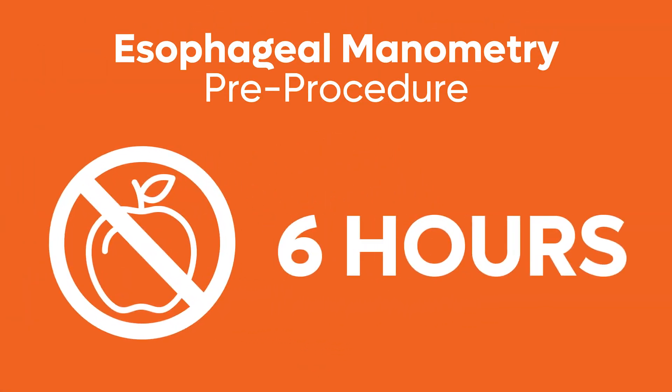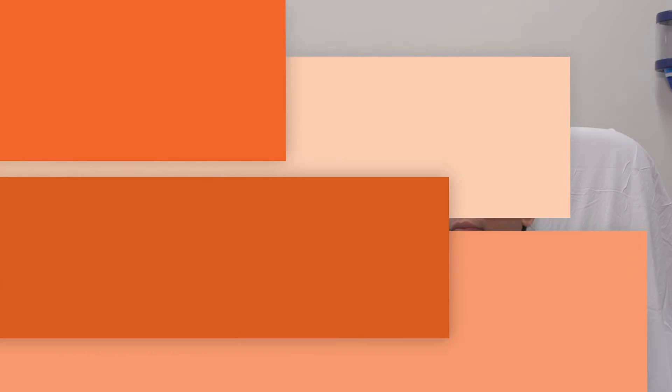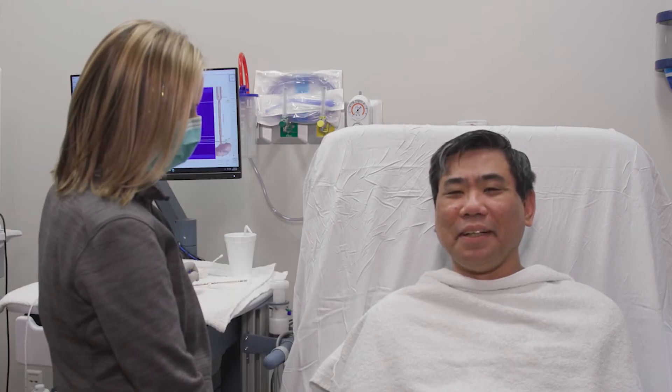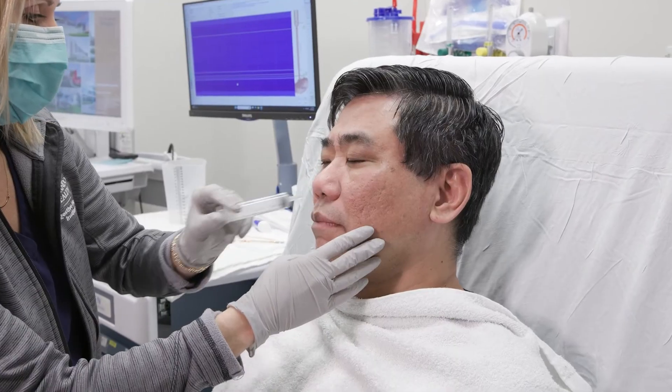The patient must fast for a minimum of six hours before the procedure. After discussing consent and medical history, the patient is positioned in an upright seated position. A numbing gel is applied to the nose to reduce discomfort from the catheter.